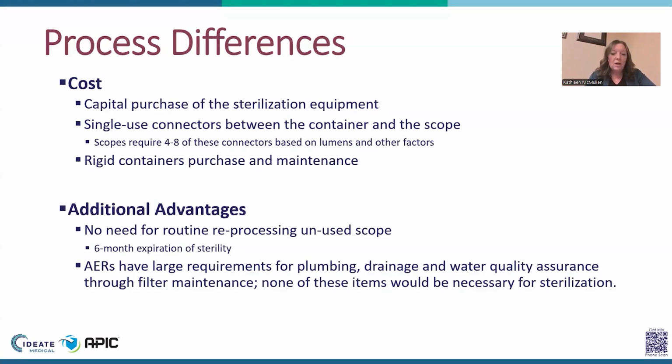And then also, again, not a full in-depth analysis, but we know AERs have a lot of requirements for plumbing, drainage, filter maintenance. And it seems that the amount of space and the amount of things necessary for this sterilizer was quite a bit smaller.